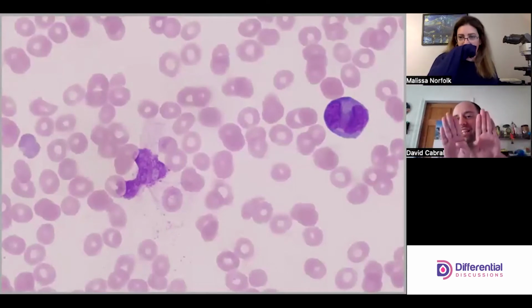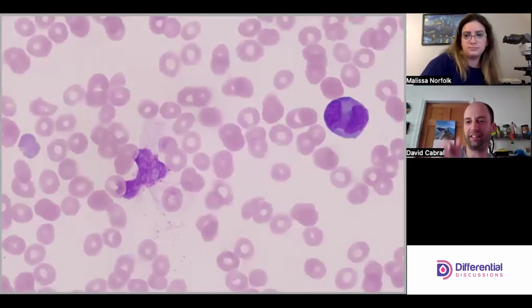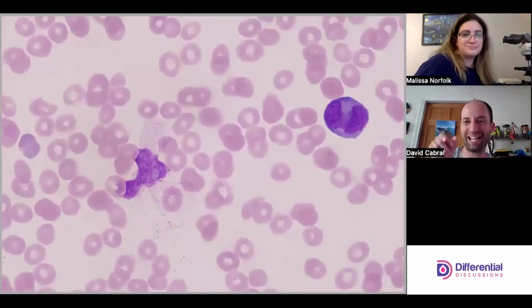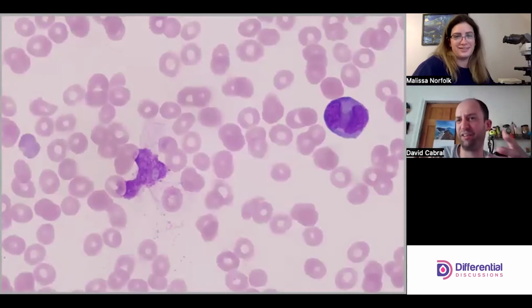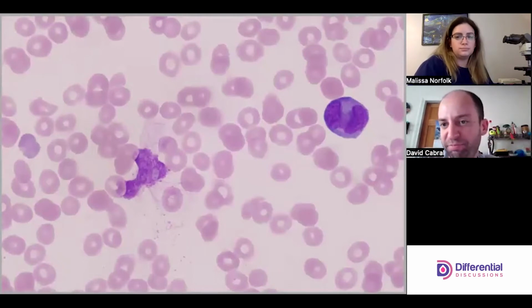So you see this, it wants to be a butterfly sort of, and you actually see the piece connecting the two sides is different in staining than the rest of it. Yeah, it's weird. Yeah, absolutely. There's the two distinct lobes. So we've got our butterfly there.